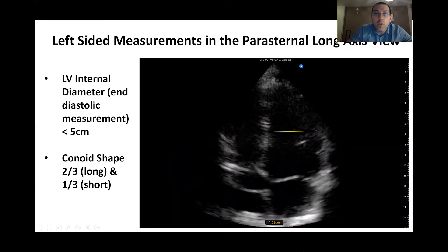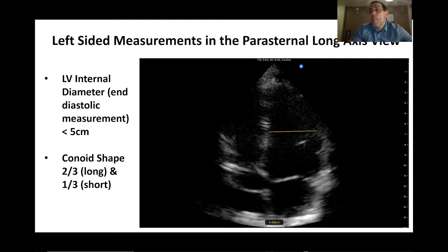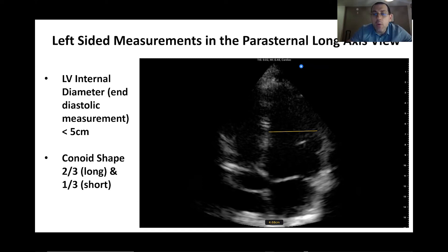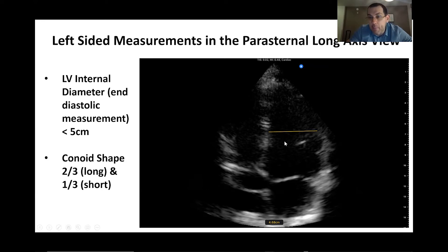The first thing we're going to look for is left-sided measurements. One of the first things is the diameter of the left ventricle — how big is normal? We take the measurement in end diastole, when it's best and also when it's biggest. In the normal individual it should be less than 5 centimeters. Here, measuring across at the midpoint of the left ventricle, I get a measurement of 4.68 centimeters, which is normal.